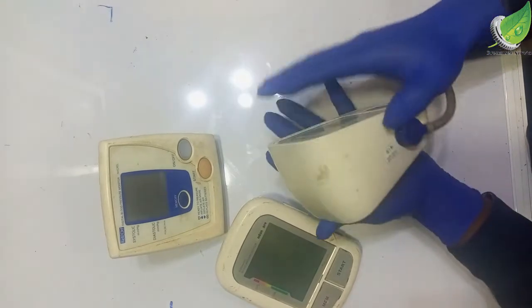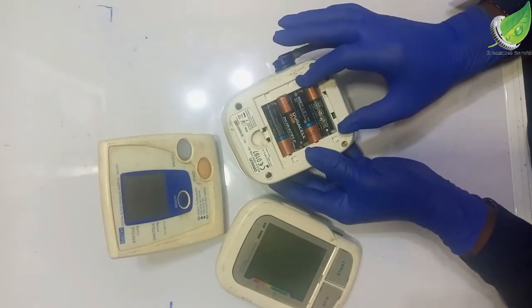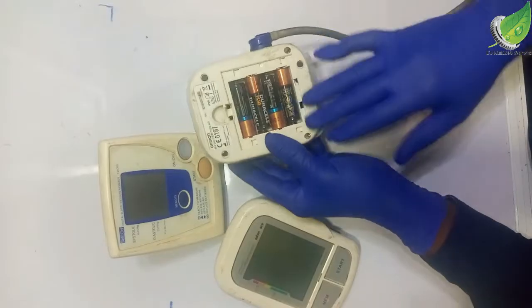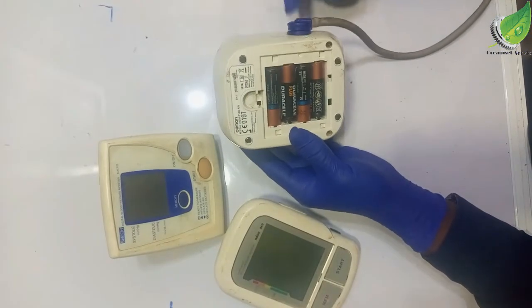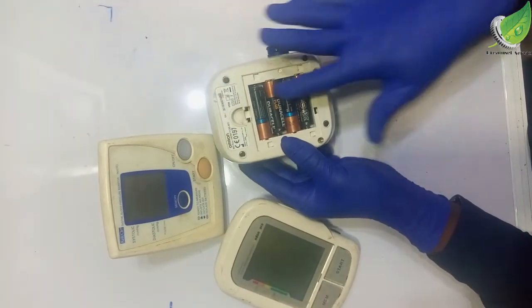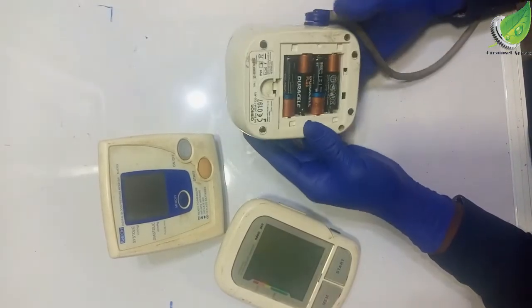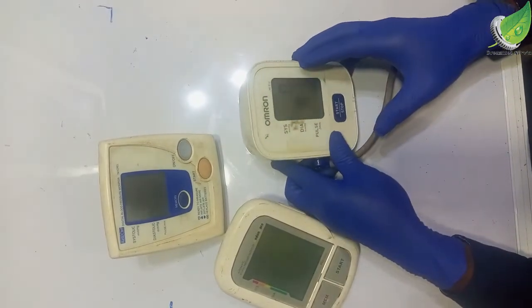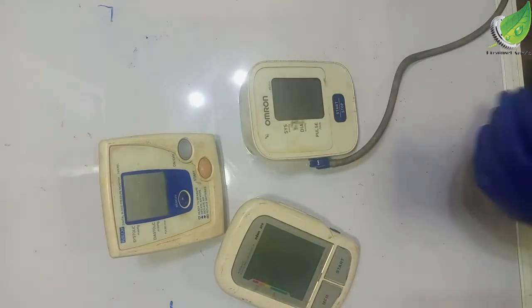One thing that you should consider again is your battery. Ensure that your batteries are okay, that none of them is weak. Sometimes you might have four batteries inside and one or two of them might be weak, and that is going to affect your reading because it will come up with this error E1 often. So check, ensure that all your batteries are in good condition and okay. So that is that for error E1.